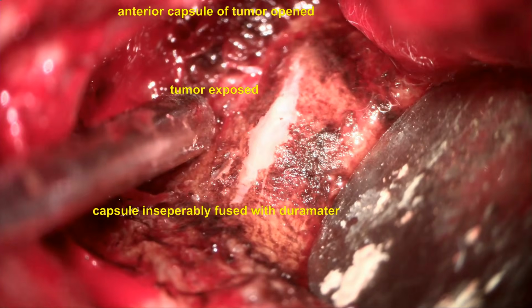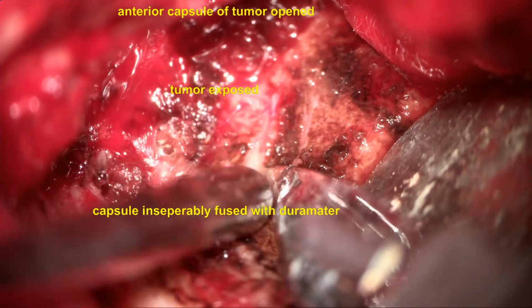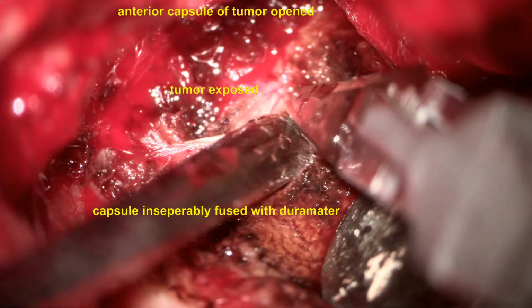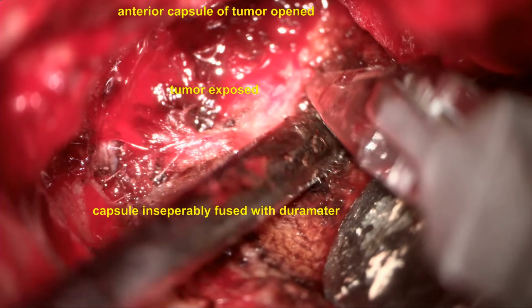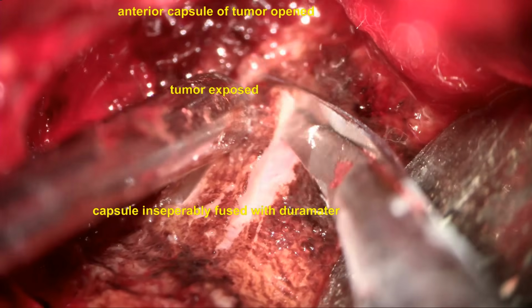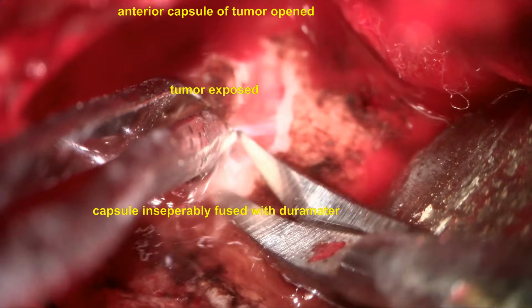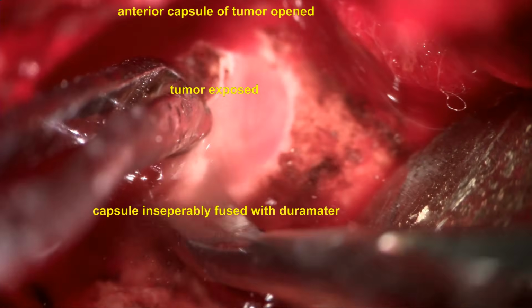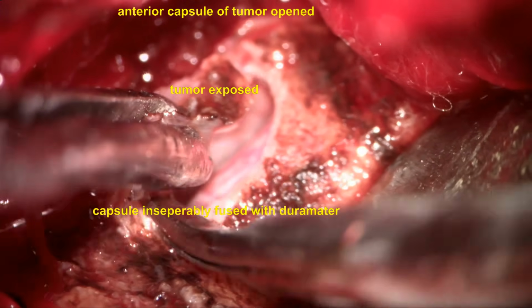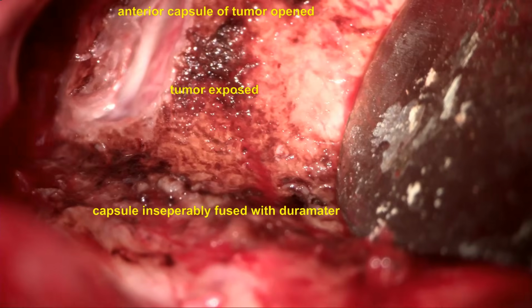Now after making an incision on the capsule of the tumor where it was firmer, we saw CSF coming out into the operating field. This suggests that the tumor capsule is inseparably fused with the basal temporal dura mater, which occurs in many cases of basal trigeminal schwannomas. The capsule will be fused inseparably with the basal dura mater.